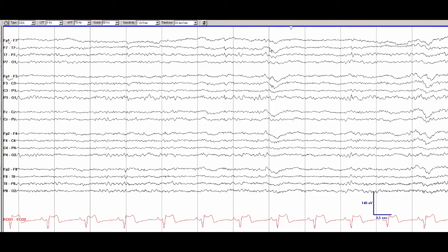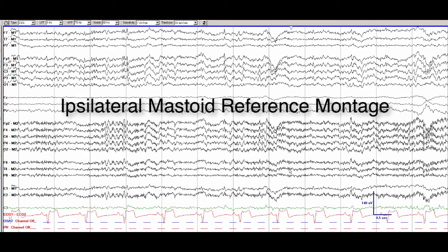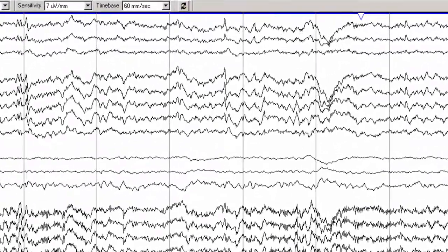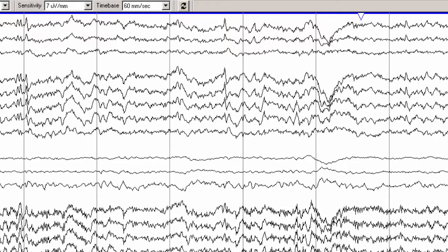One of the better ways to see this is to switch to a referential montage. Now that we switched to an ipsilateral mastoid montage, considering that we thought this was most prominent in the temporal and frontal regions, we can see that the discharge is much more easily seen as are its other neighbors.